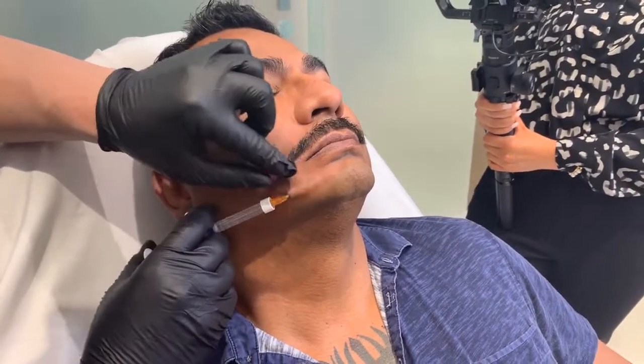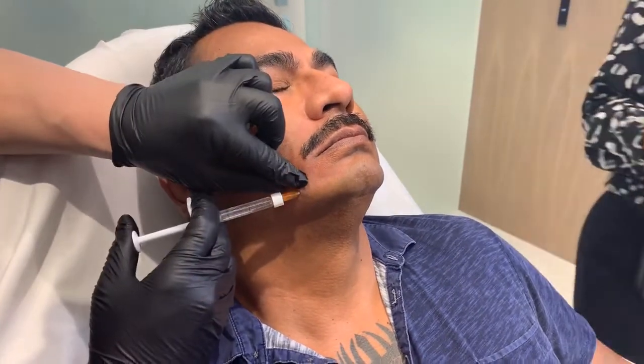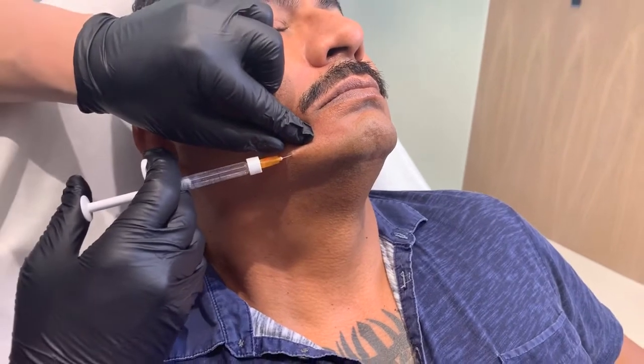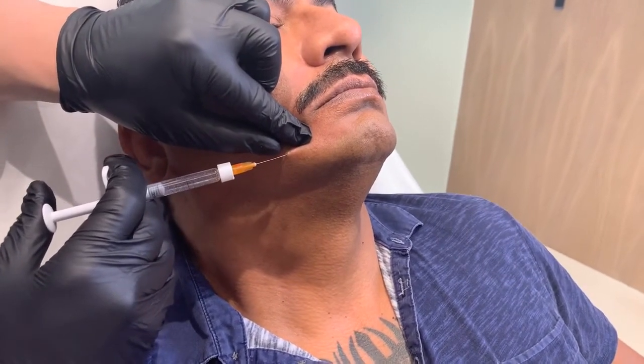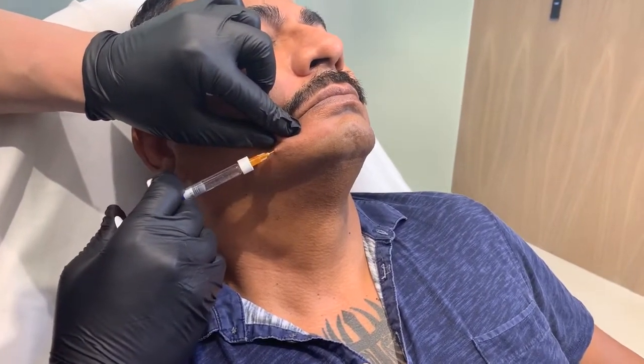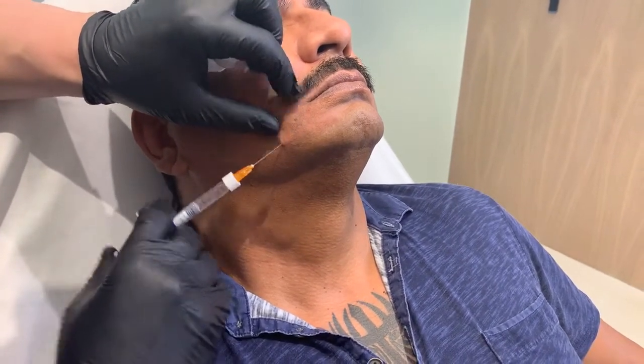We're going above his chin. You see where my cannula is. We're going above the chin. You can see, look, the volume. We're just volumizing that area very slowly. We're going to make it even in a sec. Give him some volume there.